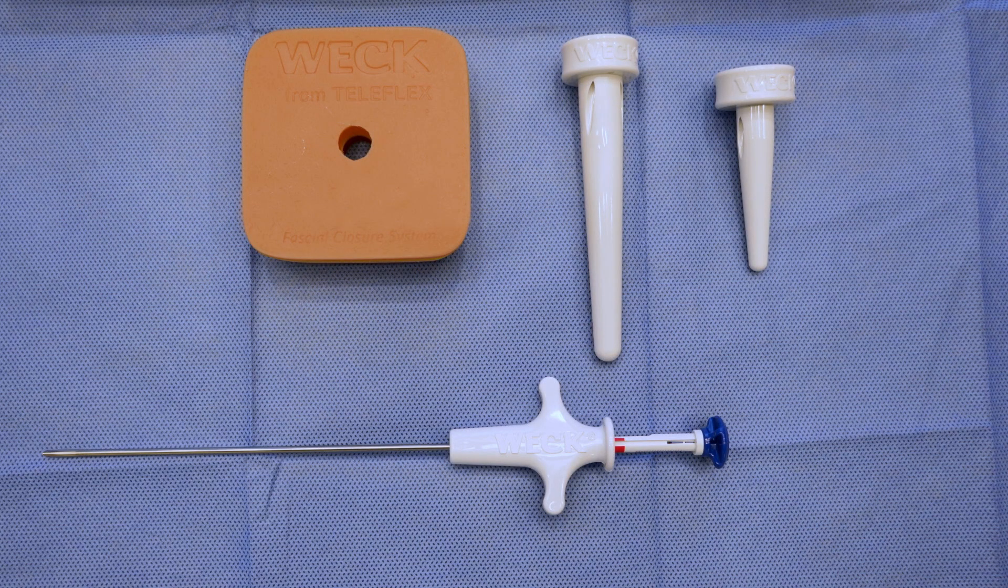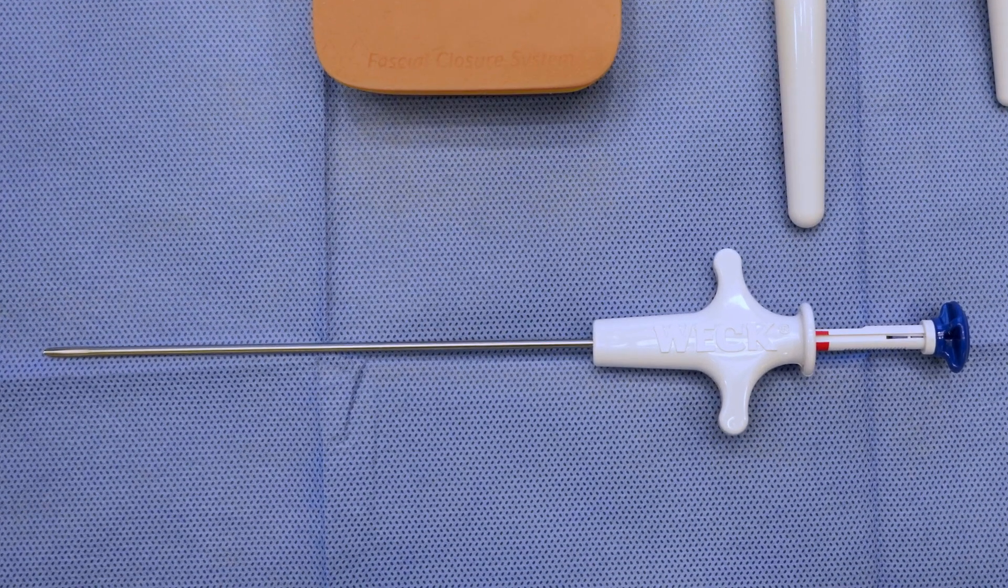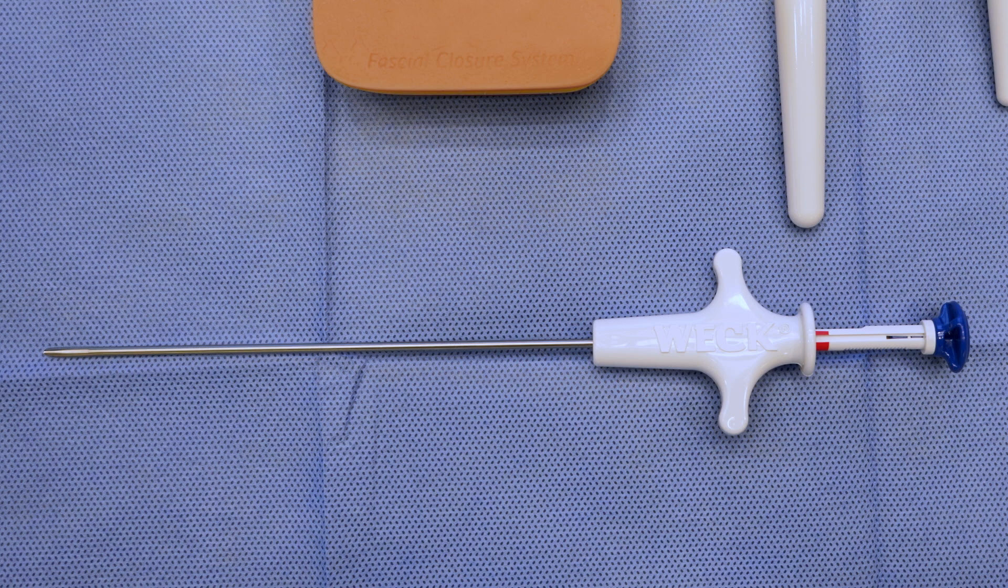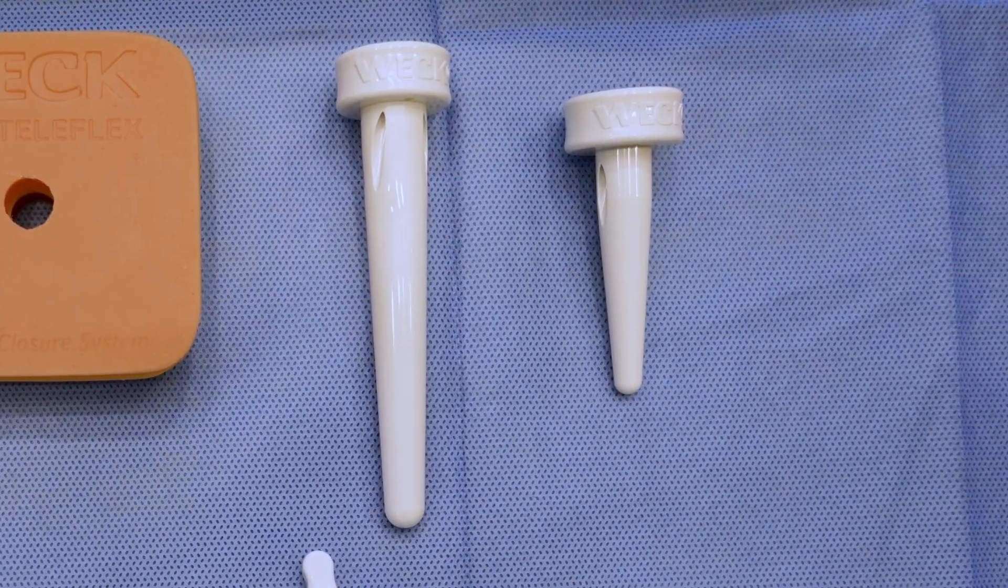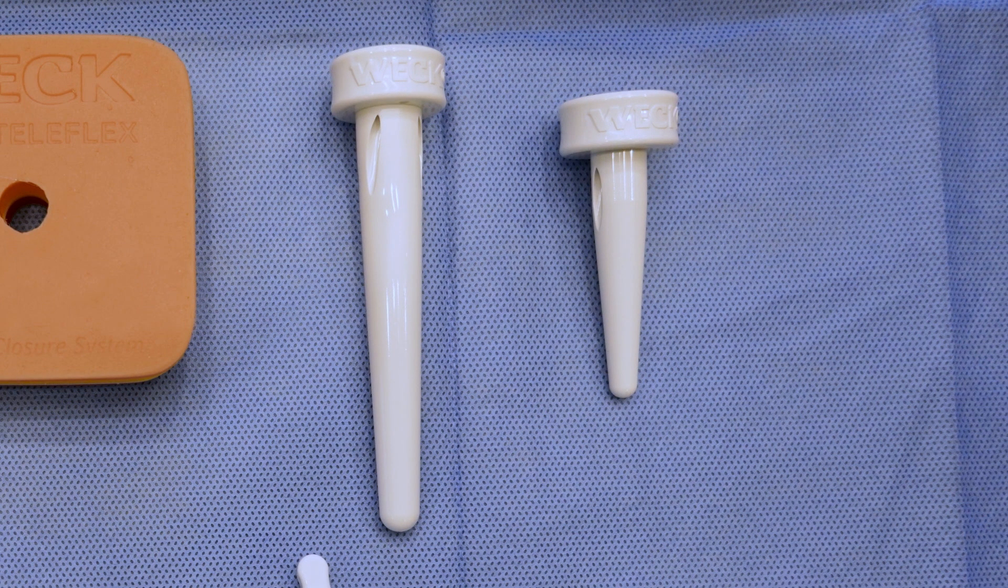The Weck EFX Classic System includes a suture passer with a passer tip that opens his grasper jaws. One end has a button and a red band that will indicate the jaws are closed. The package includes both a 10 millimeter pilot guide channel and a 15 millimeter pilot guide channel.